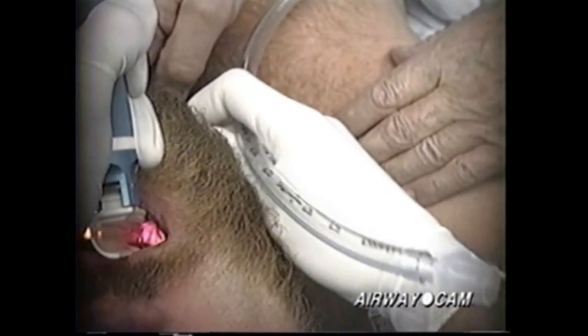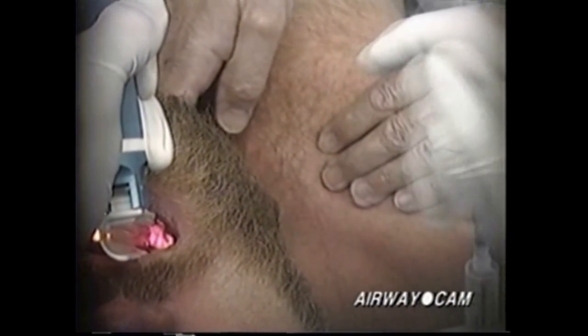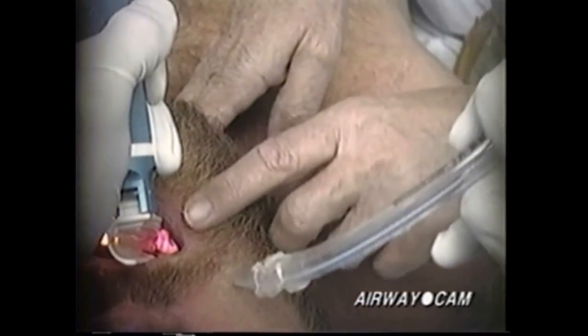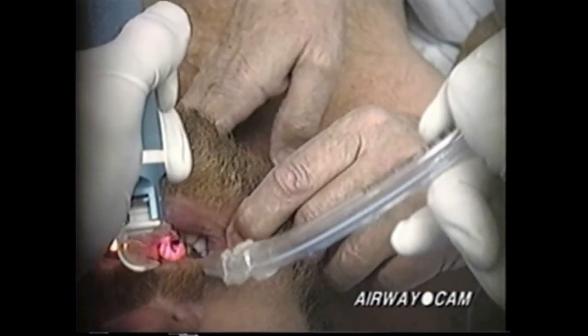The vocal cords are attached anteriorly to the thyroid cartilage. Manipulation, especially posterior displacement of this easily palpable structure, improves alignment of the larynx with the line of sight. An assistant is then used to continue pressure on the thyroid cartilage, freeing the laryngoscopist's right hand to place the endotracheal tube.